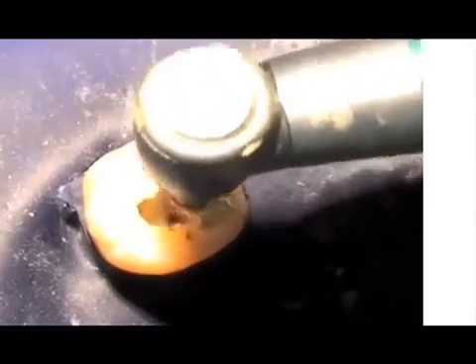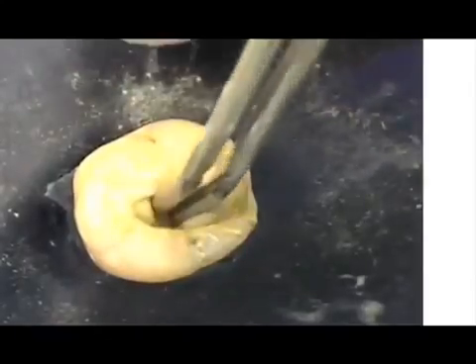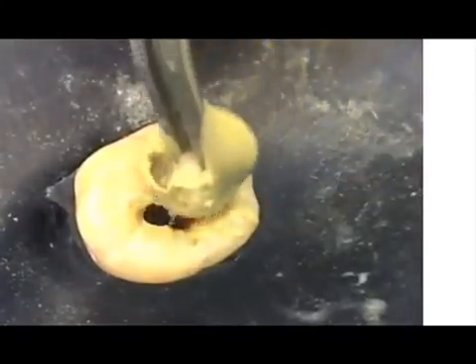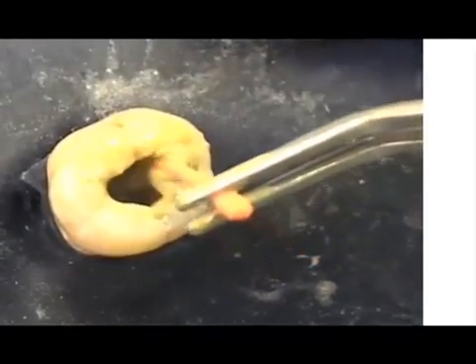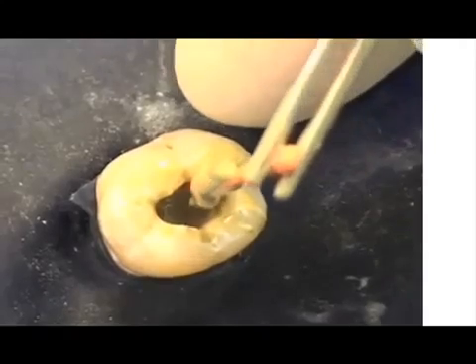However, if you feel you cannot find the canals with ease, you simply take a small ball of cotton and wipe out the excess cement in the chamber, letting you see the orifice openings of each canal more clearly. Each point is then liberally coated with cement and introduced into the canal. You know you have applied enough cement if excess escapes from the canal when you place the well-coated master point.